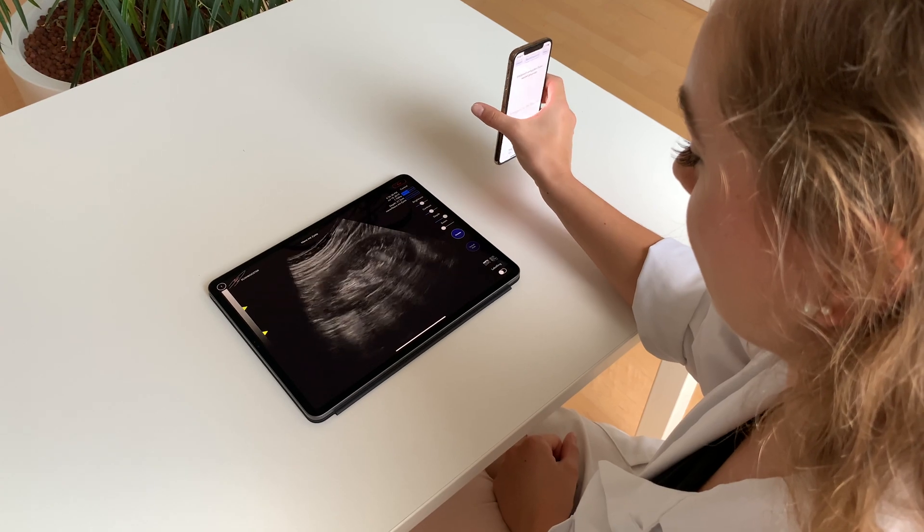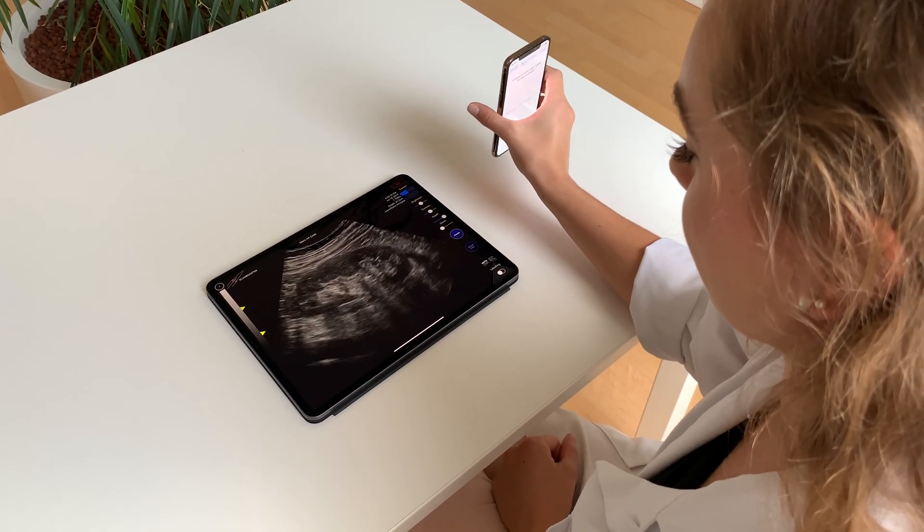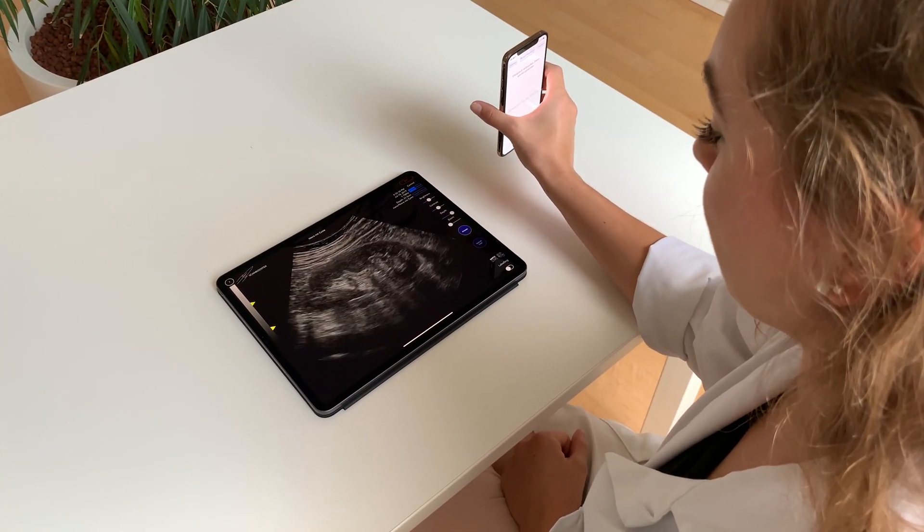With ScanBooster you can show your students different scanning techniques and protocols, observe their progress and instruct them on their scanning. All of this is live, online and completely remote.